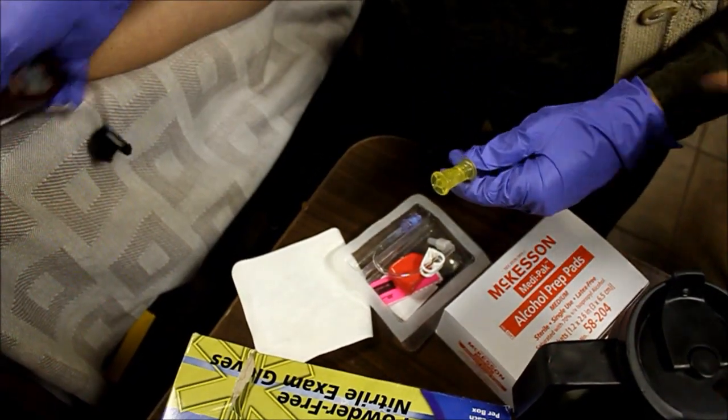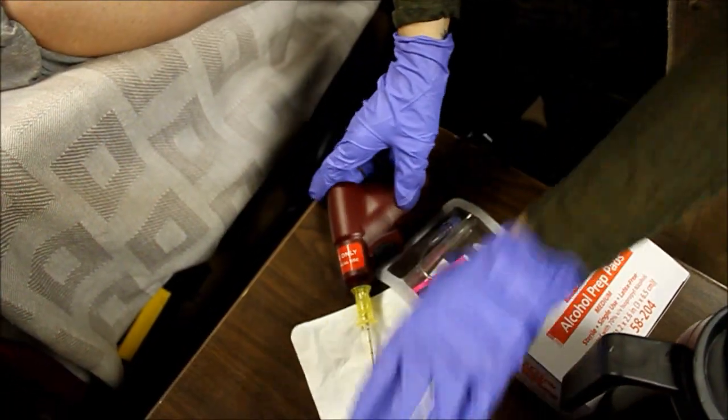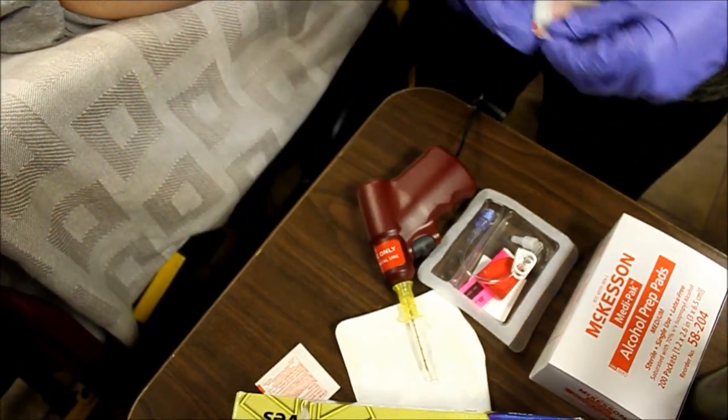Try to keep the tip of the needle sterile when you're taking the cap off. There's no movement too. I have not. We don't have them here. I can take it. Somebody just close the lid. Just close the lid. Shoulder.